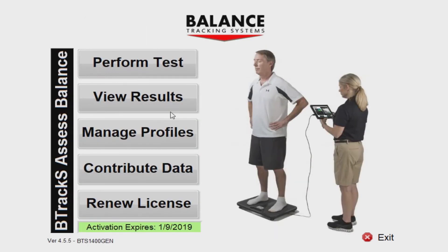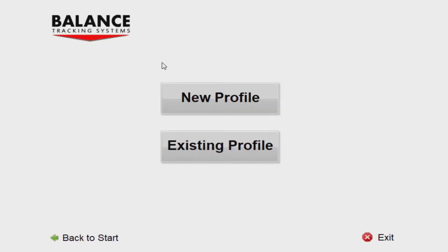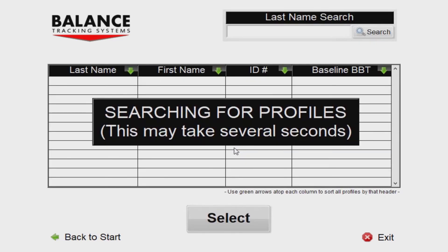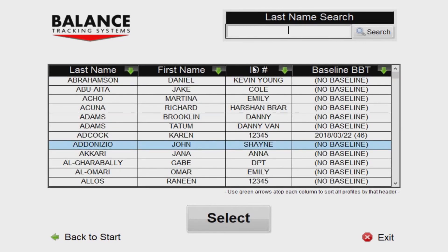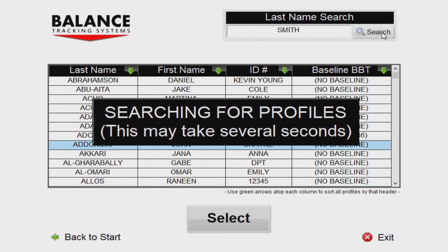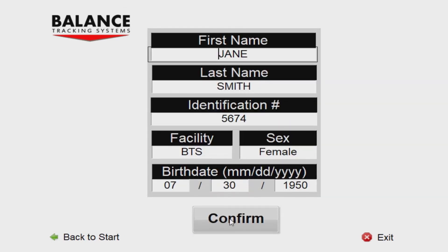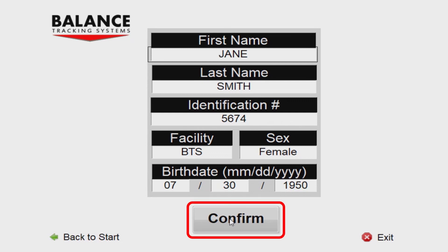Alternatively, if the person you are testing already exists in the system, press Existing Profile. This will take you to a menu where you can search and select the previously created profile. Find the person to be tested in the list and press Select when highlighted. On the next screen, make any necessary changes to the profile information. Press Confirm once everything is satisfactory.